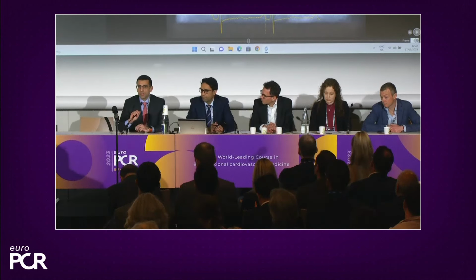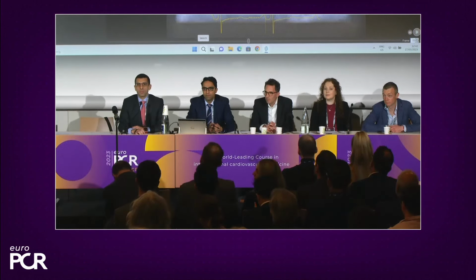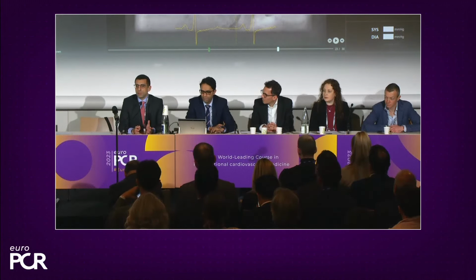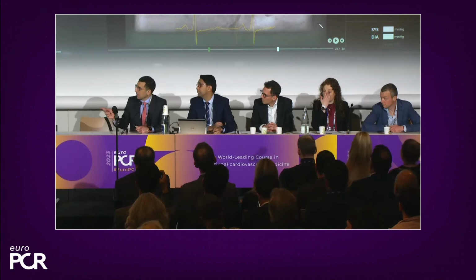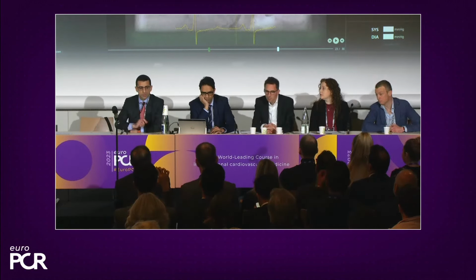Yeah, I will ask you, how many of you have access to CT FFR? So very few. So I guess the answer is how easy it is to access one technology or the other. If you have one of them, it's fine, because at least you don't end up with the problem of having the patient without knowing what to do. But if you don't have access to CT FFR, because you have to send the images out from the hospital, it is easy to have the software there, and then make either the angio-based FFR or in the worst case perform an FFR. But then I will go with the software, because you will see how it is. So Alessandra, you may drive us through the measurement.